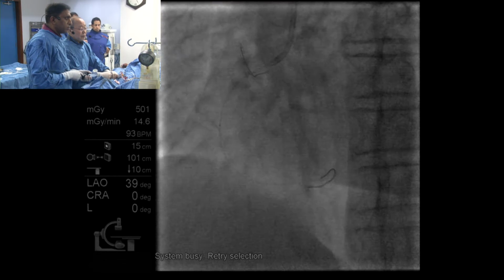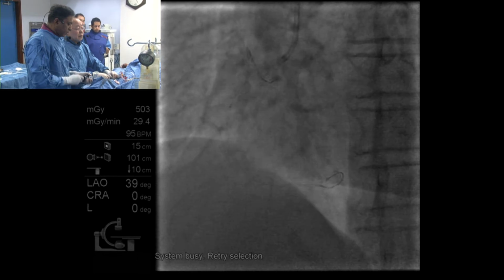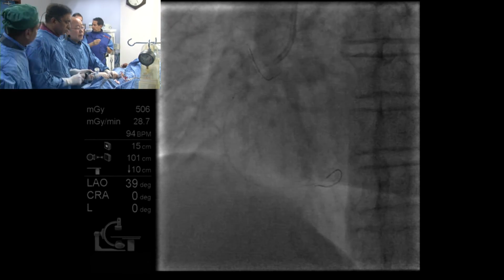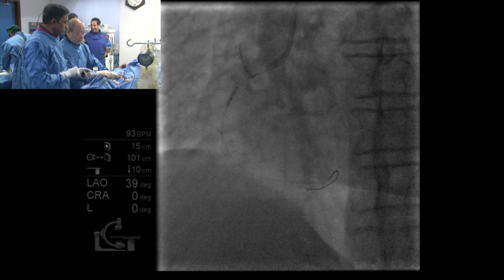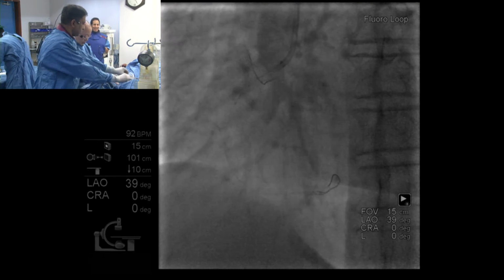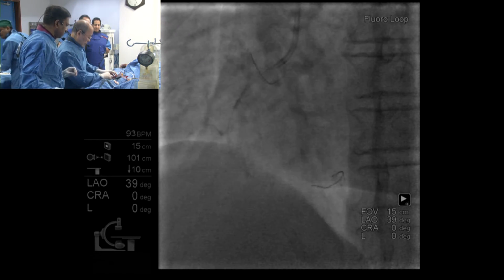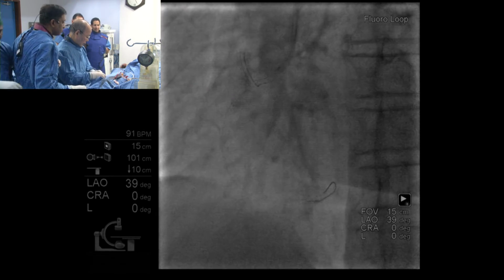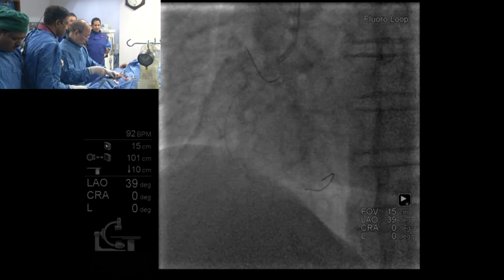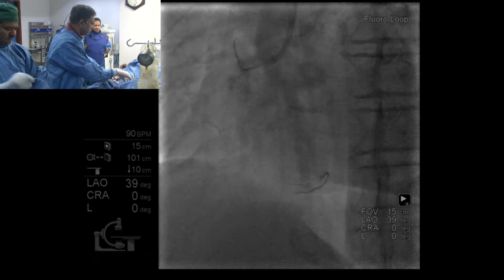Okay. And the 16. Okay. Take a check. Very tight. Oh, sorry. Okay.